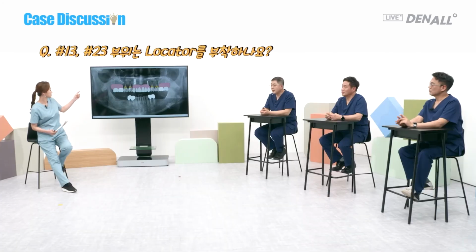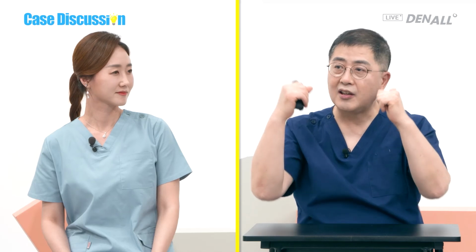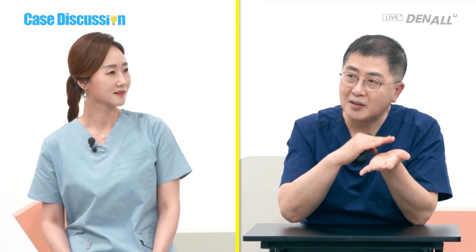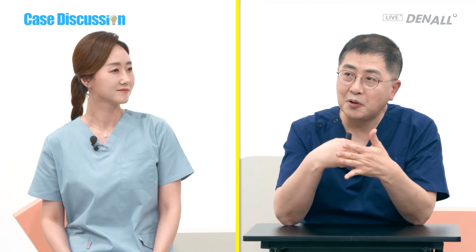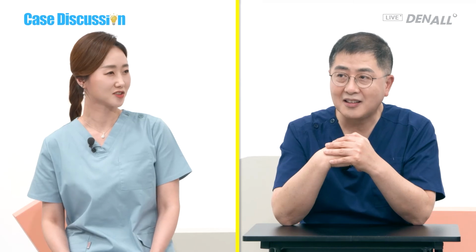What about number 13 and 23? I don't use locators there. If you use locators, actually it limits the direction of denture insertion and removal. And the middle portion of them would be filled with resin and they need to be buried. So they're in a sleeping status.